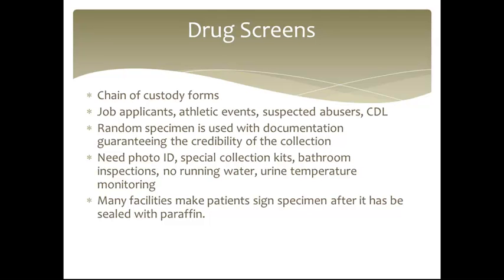So it is important to record that time in military time and follow the protocol to make sure there are no hiccups in the collection system. Sometimes these cases can go into a court of law over whether the collection was done properly, and a case can be thrown out if we do not collect it properly.